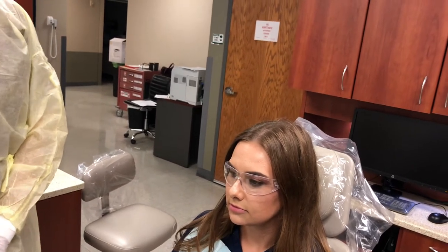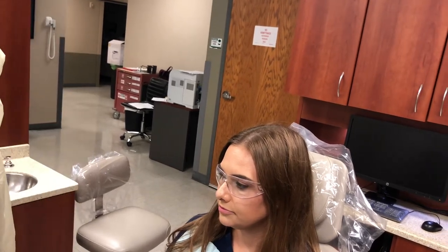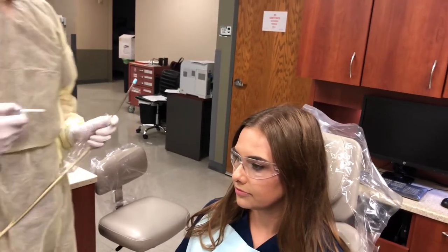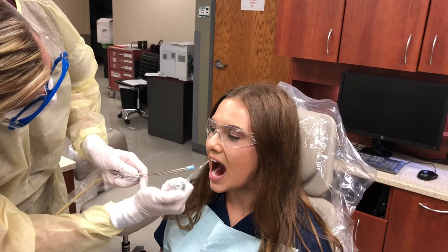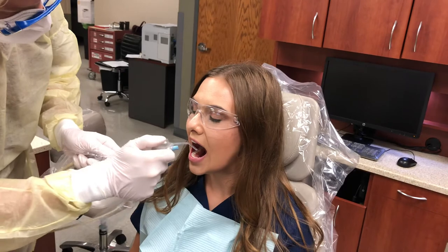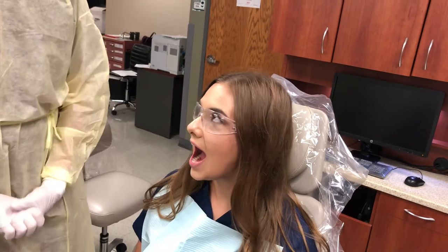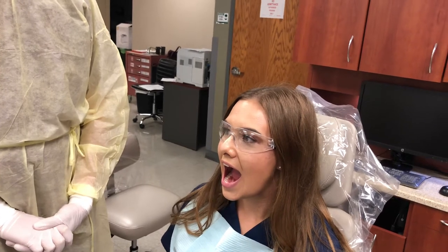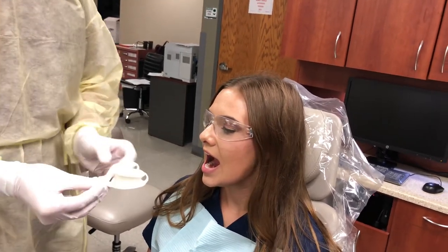Dry the teeth by placing a saliva ejector in the mouth while using the air syringe to dry the maxillary teeth first and then the mandibular. We will not be creating aerosols so we will not be actually doing this step. You would blow air maxillary first and then mandibular with the saliva ejector in, and then instruct the patient to remain open so that there is no dilution of the fluoride. If they close, you must start over with drying the teeth — maxillary first and then mandibular.